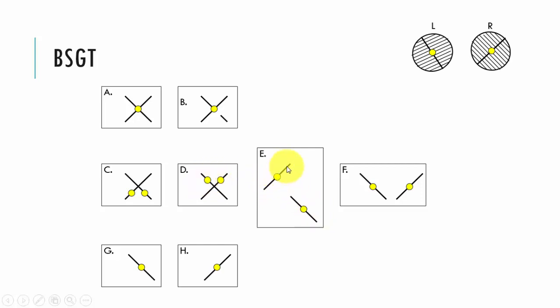So what we see here is that the right light is above the left line, which indicates that we have a left on right. And here, I just wanted to show you that you can also have the lines quite separated from one another, which all it means is that the deviation is greater, so they don't actually end up crossing over one another. So in this instance, you just have a look that's left remaining on left side, right remaining on right side. So we have uncrossed diplopia there.